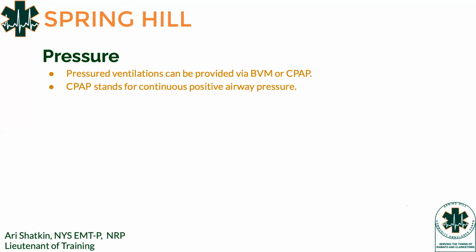When dealing with someone who's an unresponsive patient, BVM ventilations are almost always indicated. You'd also use a BVM for a flail chest segment. If you guys still remember that, what's the treatment for a flail chest segment? What was that? Right, positive airway pressure is the main point. Why? Since we just got a nice refresher on the airway.